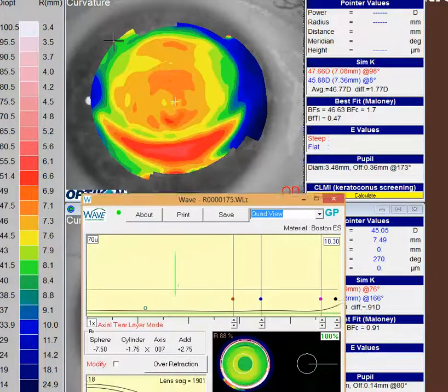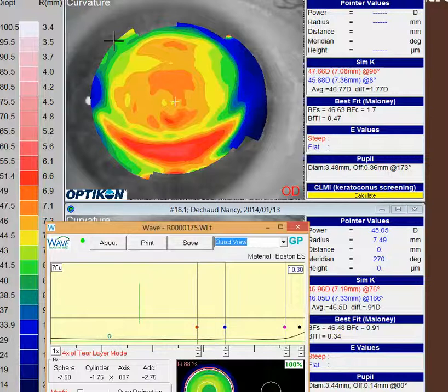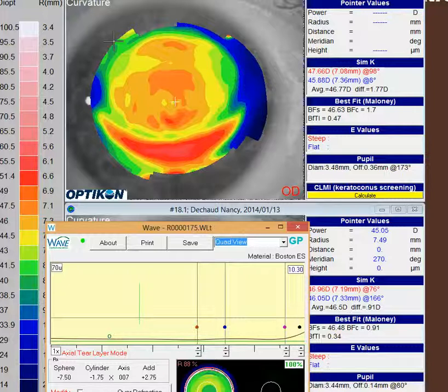So let's take a look at these designs. Actually another comment on this topography. One of the things I try to do if I see an initial presenting topography like this, I sort of from past experience have realized that I usually run into fitting difficulties with it. So I try to get a little nicer, cleaner topography by getting the patient to stay out of their lenses for a few days.